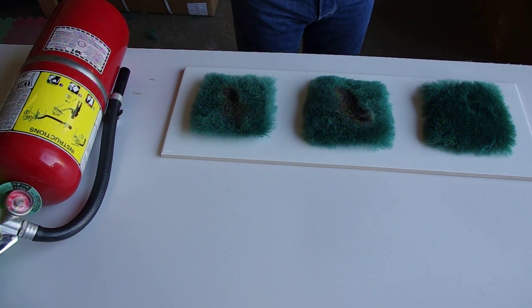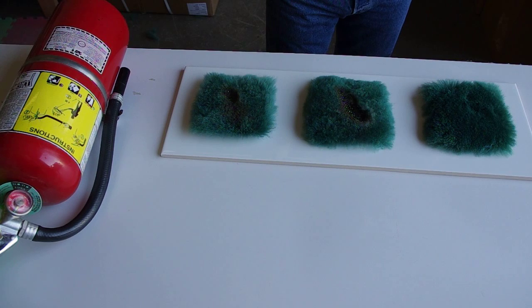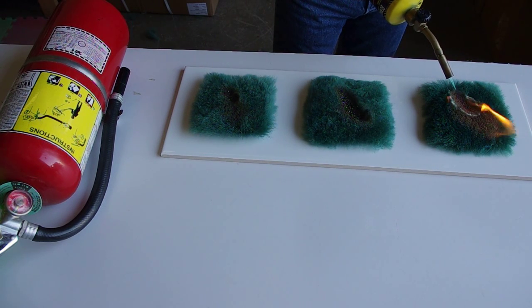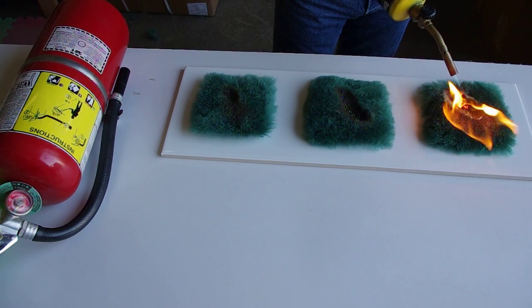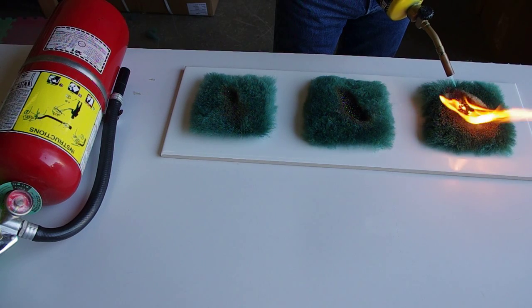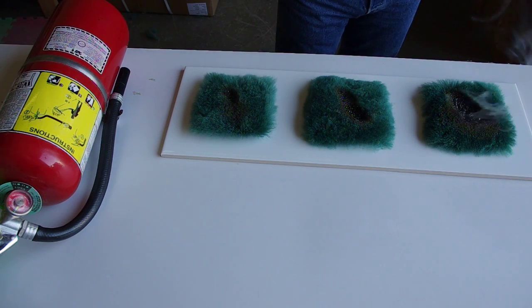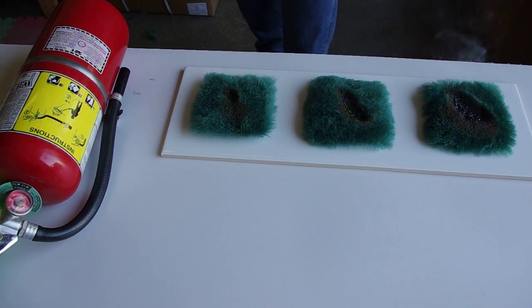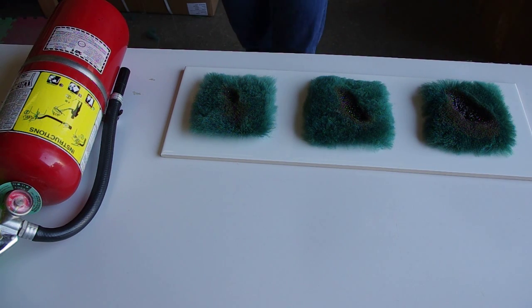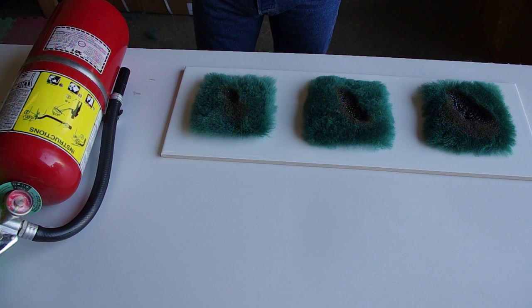On the third piece, we are going to perform a ten-second burn, and that will begin now. You can see that the flame did not transfer laterally. The product self-extinguished within one second. And you can see that the only byproducts produced when burning Australian medical sheepskin is smoke and ash.